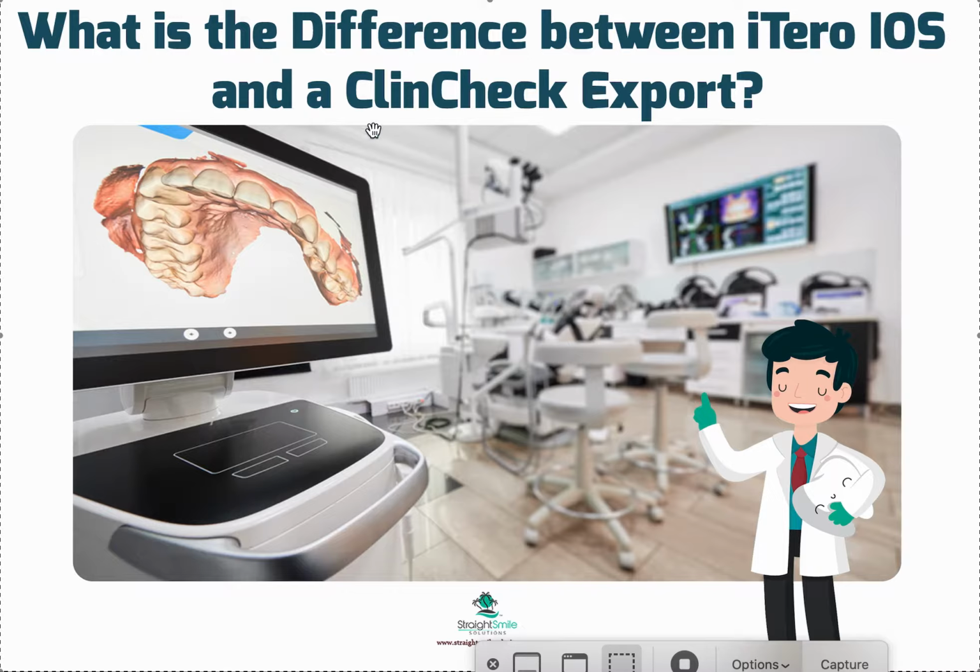Now, your doctor doesn't have to have an iTero scanner in order to get a ClinCheck. You might take impressions. You might use another type of scanner. You might use an iTero scanner. Lots of different ways that you can get the information. All that information is uploaded along with some photos and maybe an x-ray into the Invisalign software. Your doctor will communicate with their technicians to get a detailed setup of exactly how they want to move your teeth, how they move, how they tip. And there's a lot of artistic skill that goes into designing a ClinCheck.